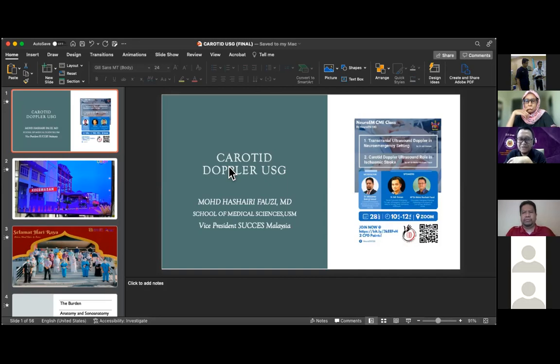Agree. Thank you for your info. I think this is the way forward, because previously in ED we used the carotid Doppler for VTI, I mean for fluid responsiveness. So we never thought about looking into stenosis in stroke patients and so on and so forth. We used the peak systolic velocity, the flow itself, for determining fluid responsiveness. But this is a new tool, and I think it is very useful for us. Yeah, thank you, Dr. Ashraf.